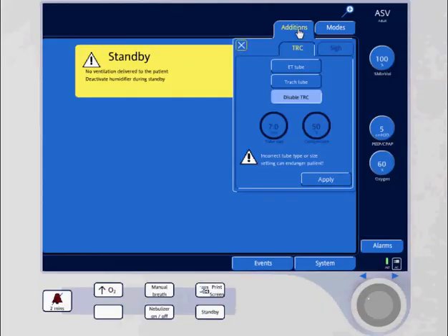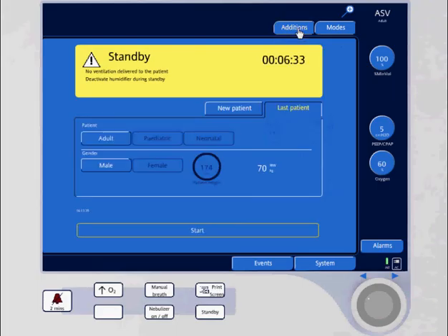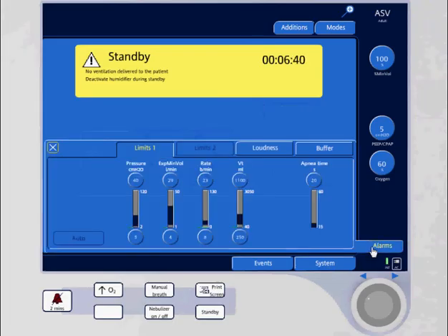Under additions, I can select TRC, otherwise known as automatic tubing compensation, and I can preset my alarms before I even put it on the patient.